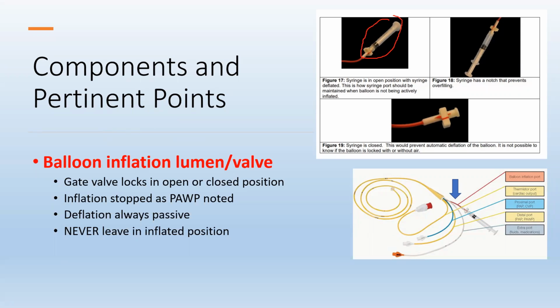At the distal end of the catheter is actually right over here a latex rubber balloon, and it has a capacity of 1.5 mLs, which when inflated, extends slightly beyond the tip of the catheter without obstructing it. So what is the purpose of the balloon? Well, first of all, the balloon inflation cushions the tip of the catheter and prevents contact with the right ventricular wall during insertion.